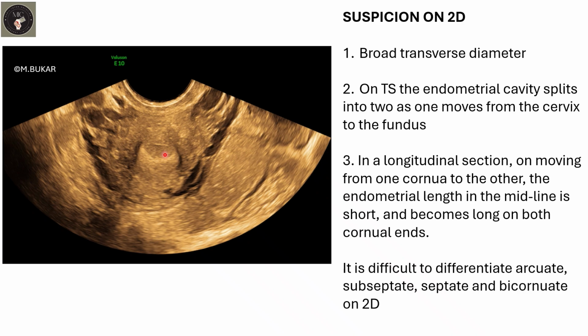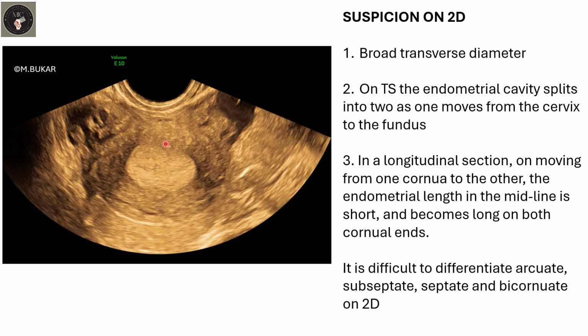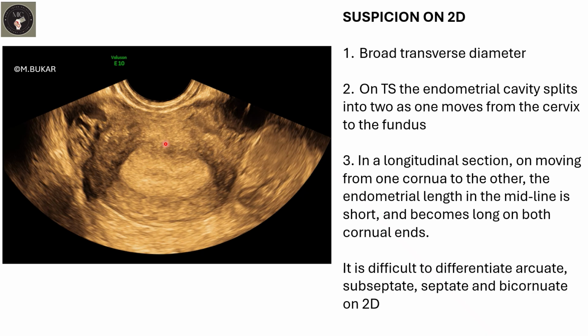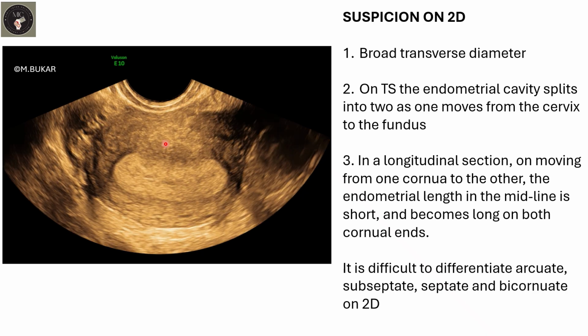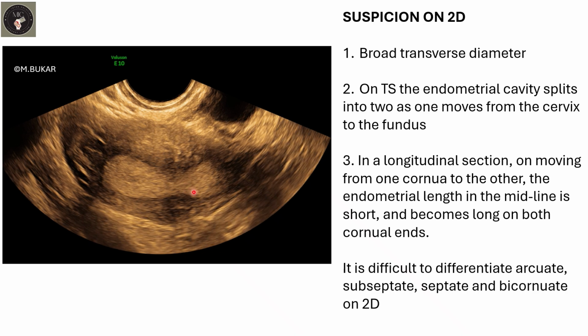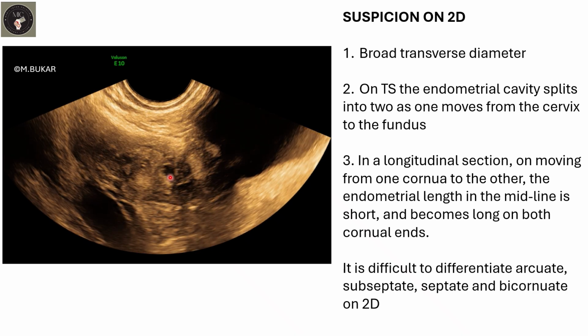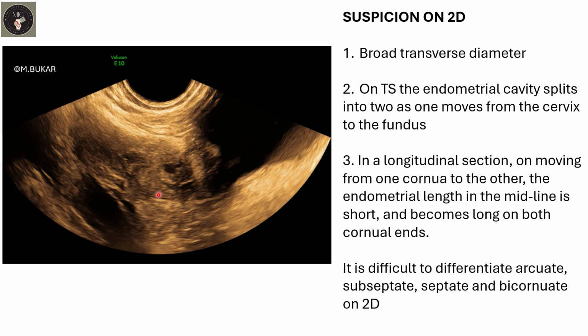So this is cervix. Now as we move towards the fundus, note this split of endometrial cavity.